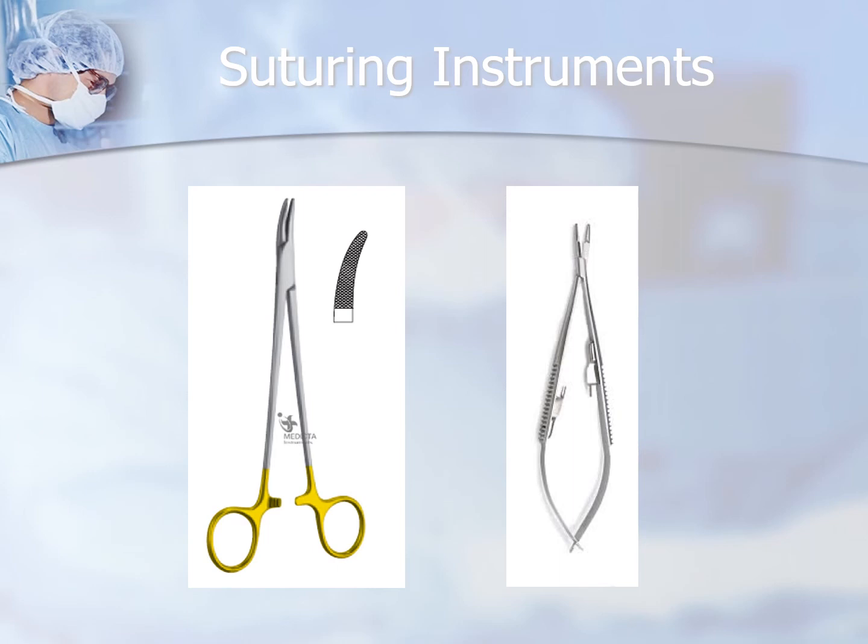And this one on the right is called a Castroviejo. We'll see it again down the line here, a couple slides, but it is also used in microsurgery and vascular surgery as well. And it has the locking mechanism inside the handle here, as you can see.